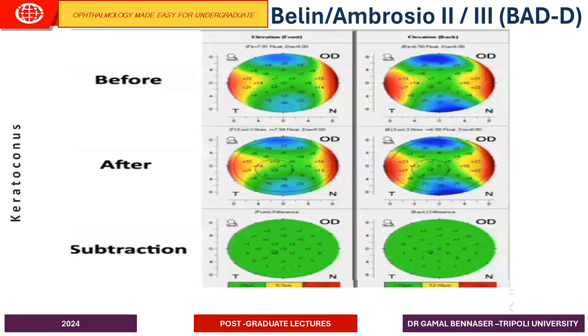This cornea should be screened using the BAD display to determine whether it is a normal or abnormal cornea. An abnormal cornea does not necessarily mean that it is going to develop keratoconus, because these corneas might be subclinical, or what's called forme fruste keratoconus. So they will be stationary unless you interfere with laser vision correction. At that time, there might be an iatrogenic keratoconus. So what I want to say is that the Belin-Ambrósio display is not specific for keratoconus, but it helps you to differentiate between normal and abnormal corneas. Hence, its best application is for refractive screening, to exclude corneas that are suspicious.